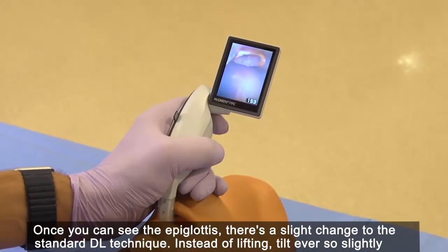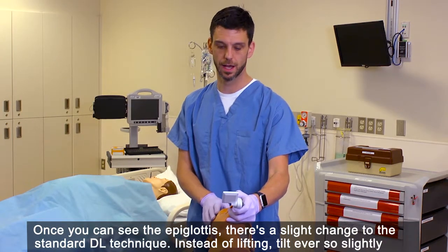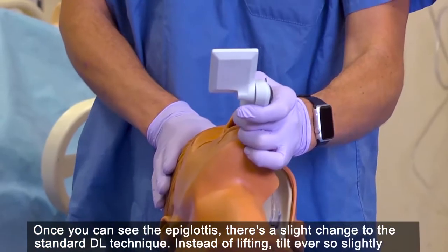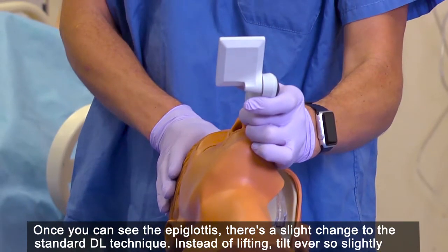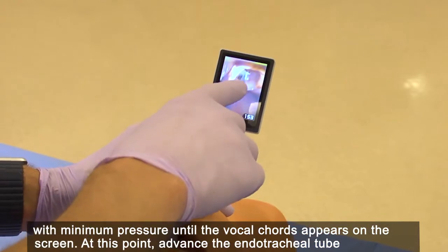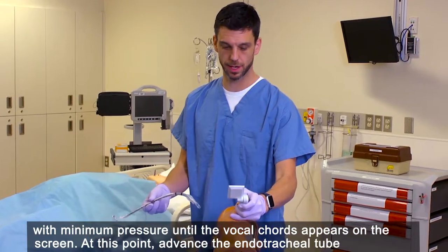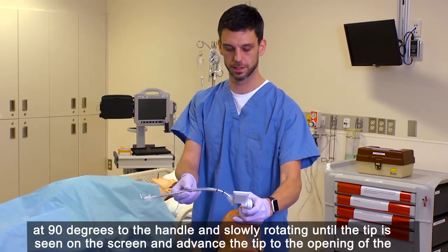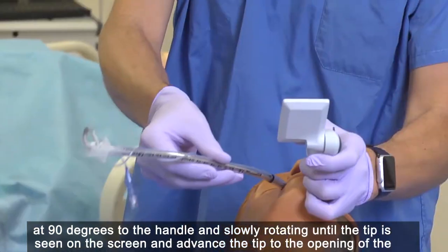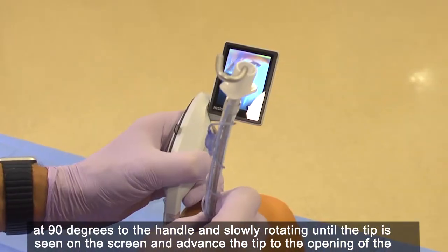Once you can see the epiglottis, there's a slight change to the standard DL technique. Instead of lifting, tilt ever so slightly with minimum pressure until the vocal cords appear on the screen. At this point, advance the endotracheal tube at 90 degrees to the handle and slowly rotating until the tip is seen on the screen.